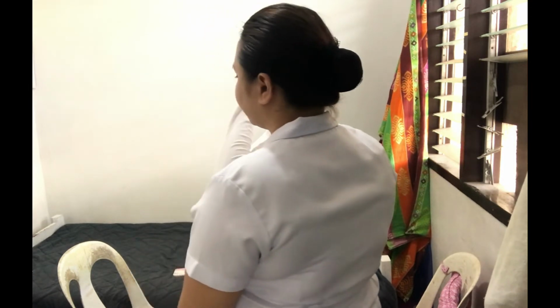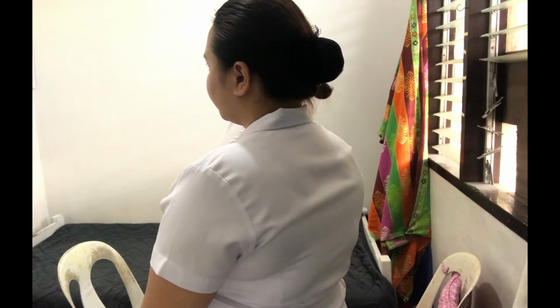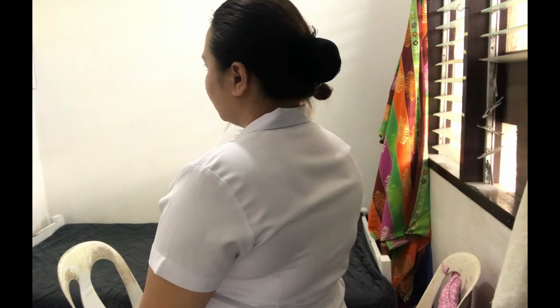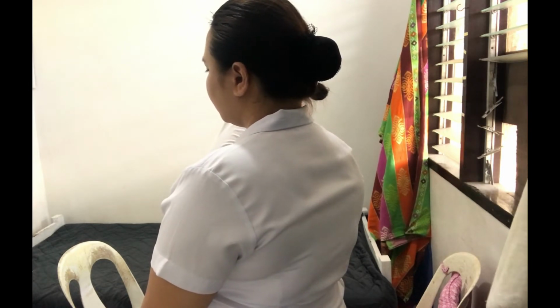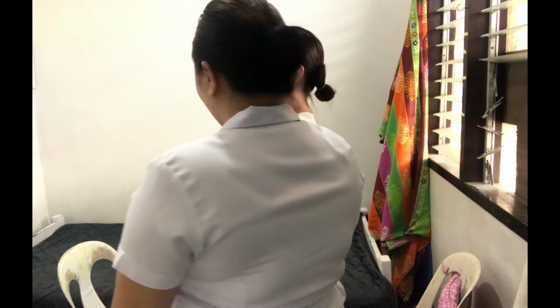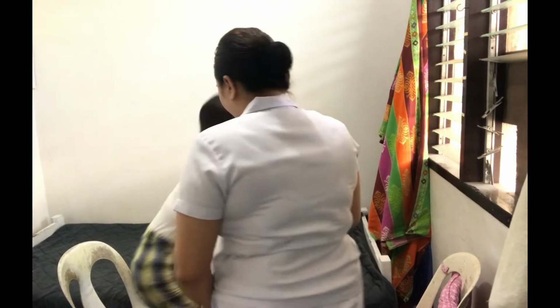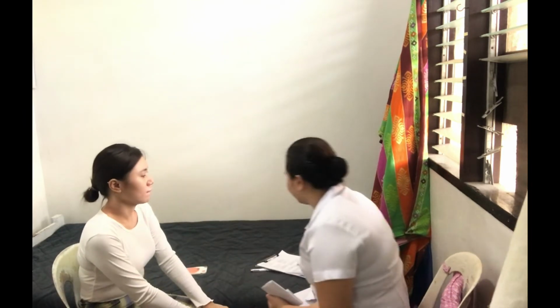Next eye. E, F, P, T, O, Z, L, P, E, D, P, E, C, F, D, E, D, F, C, Z, P, F, E, L, O, P, Z, D, D, F, T, D, E, F, P, O, T, P, E, C. Okay, ma'am. Thank you. And you can sit back now. Now, I will record the assessment.